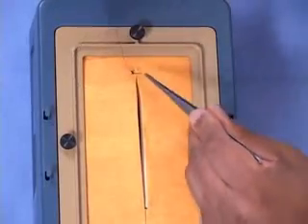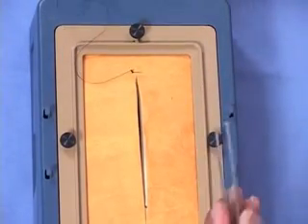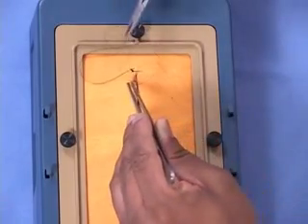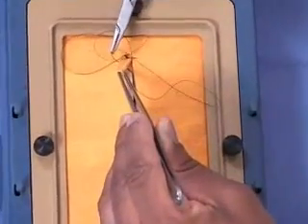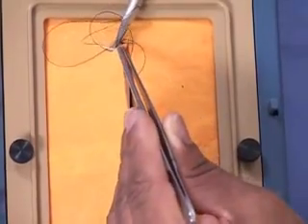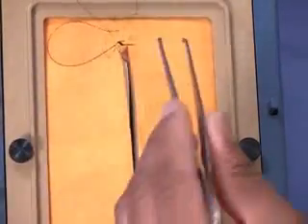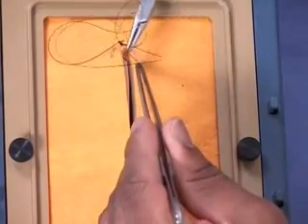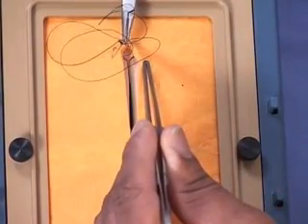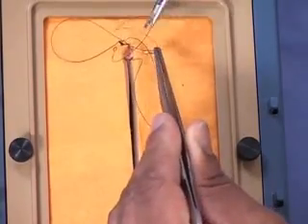Next, I'm going to demonstrate the running locking stitch on the skin simulator. Notice that the first stitch has been placed and tied. Now, you'll start by elevating the far side so that you have clear visualization and pass your needle through. Now, you'll come over to the near side, elevate, and pass your needle through again.